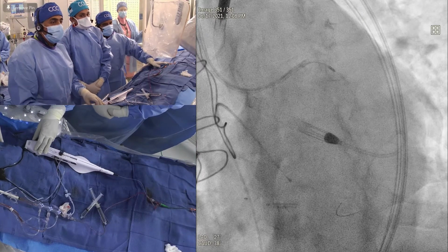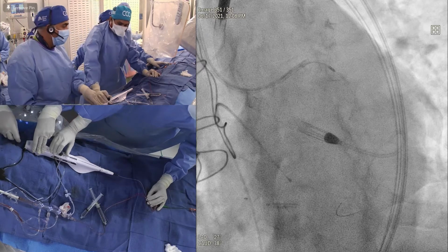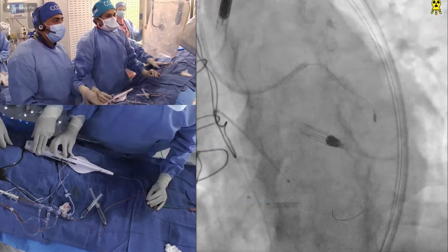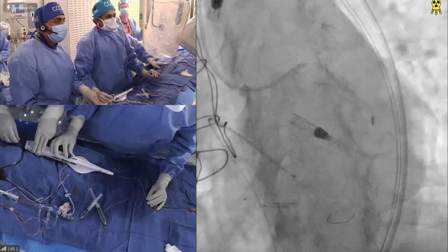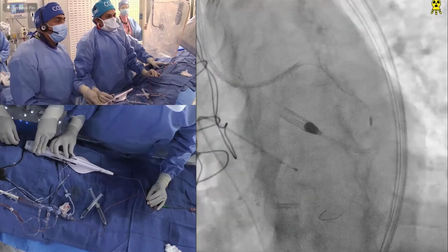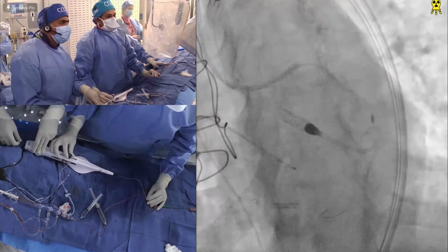But you need that. And then of course you can always upgrade it. Okay. A breather for the patient and a breather for the operator. Yeah, for sure. You're really happy that you have the Impella in place, guys. I don't know that anyone is questioning that choice. Would anyone on the panel do this without support?